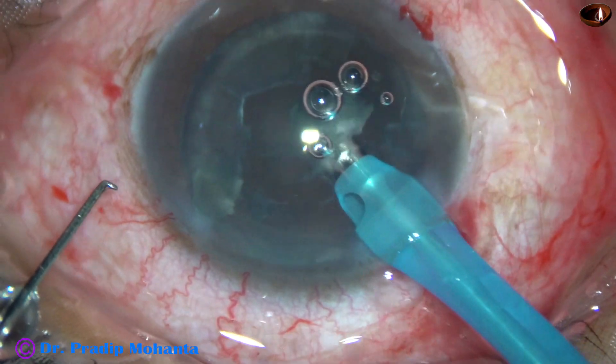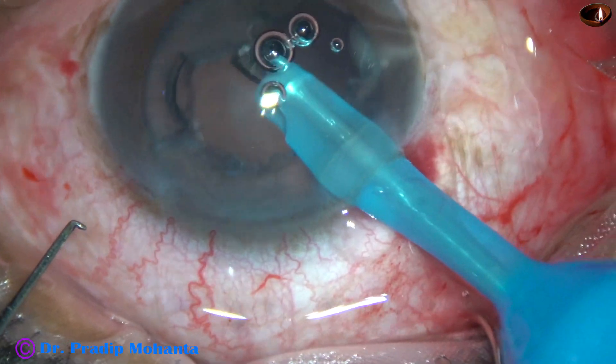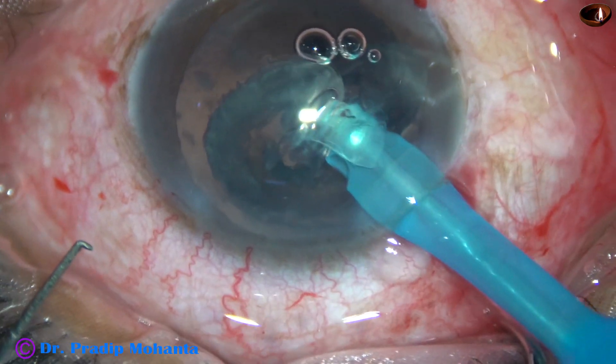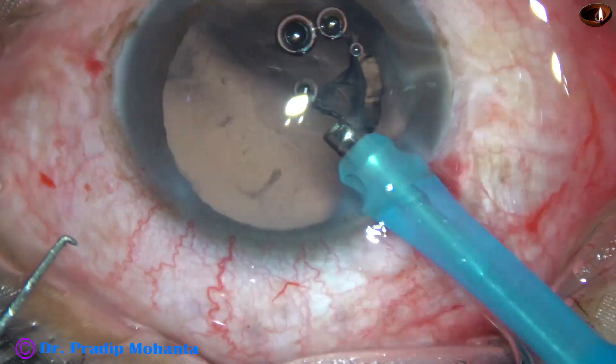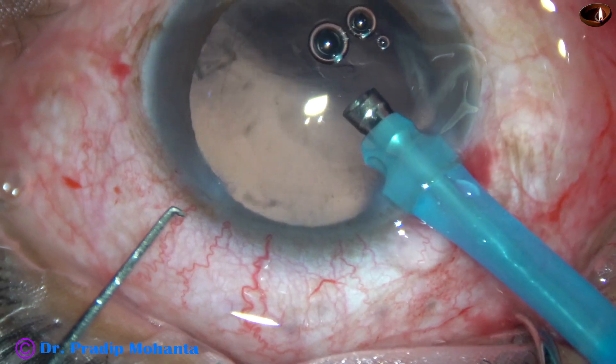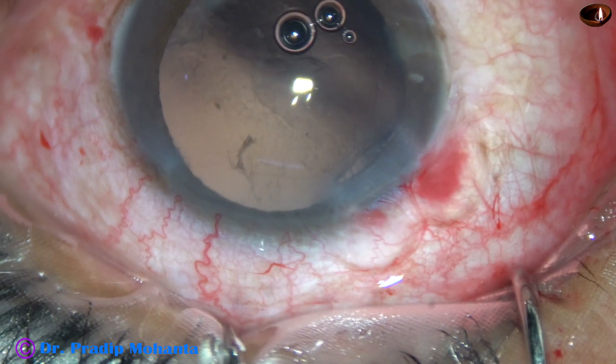The ultrasonic energy used in this case is 60%, flow rate was 45, and vacuum 450 mmHg. And in this case, you can see that all the cortex has almost come out.